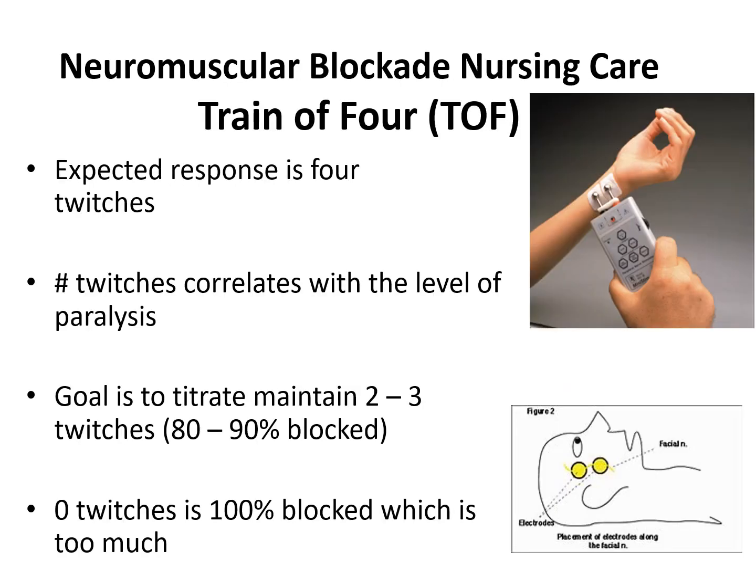So if you have any kind of neuromuscular blockade, you need to do a train of 4 because long-term use of neuromuscular blockades can result in prolonged paralysis, the inability to wean, and skeletal muscle weakness. So to avoid this complication, the patient's level of paralysis must be carefully monitored with a peripheral nerve stimulator. It depends on the number of correlated twitches with the level of paralysis. So you make sure to correlate the patient with the train of four.